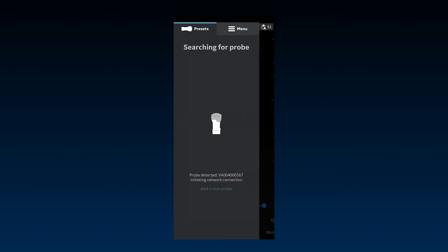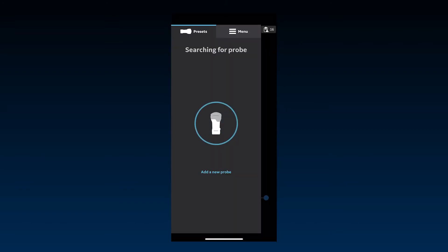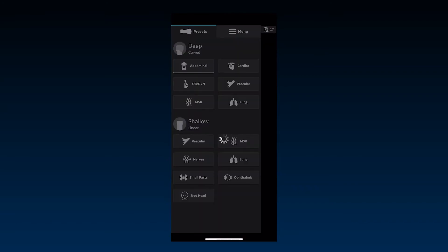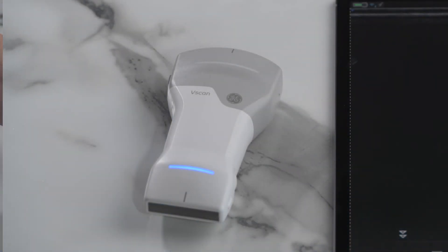On Android devices, the user is quickly taken to the scan screen to start scanning. On iOS devices, the user needs to confirm pairing with the identified probe before the screen will change to the scan screen. Once paired, you're ready to scan. The connected side of the probe will display a steady blue light.